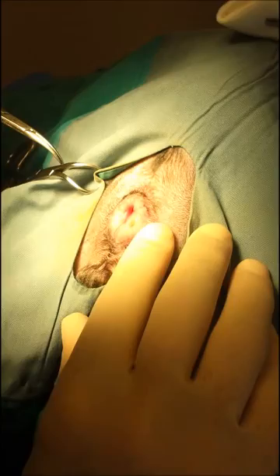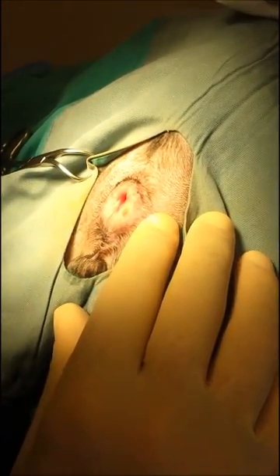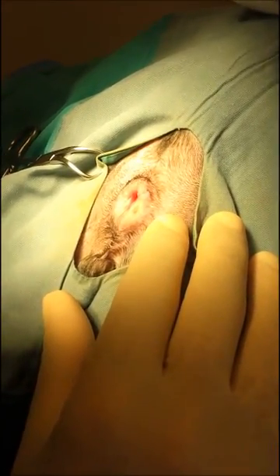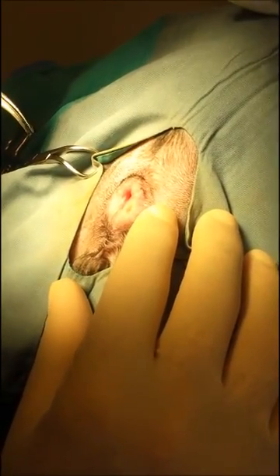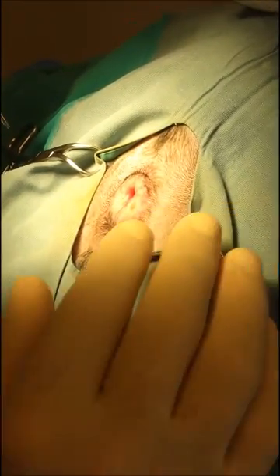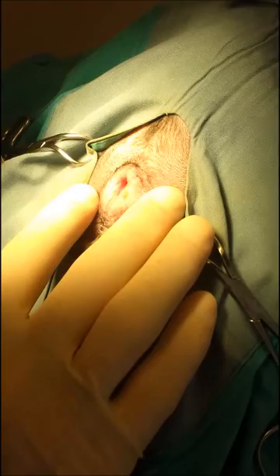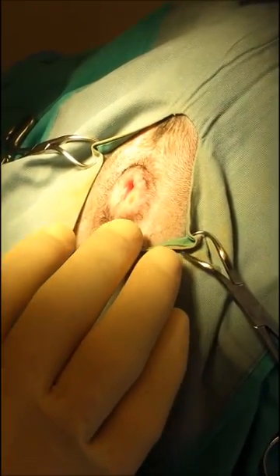We've prepped the anus and put gauze inside the rectum. Before any of this, we gave the animal an enema this morning, and he's been NPO'd for food for 24 hours, and we withheld water after midnight last night. So no food for 24 hours, enema this morning, and then some gauze in the rectum to decrease any contamination.